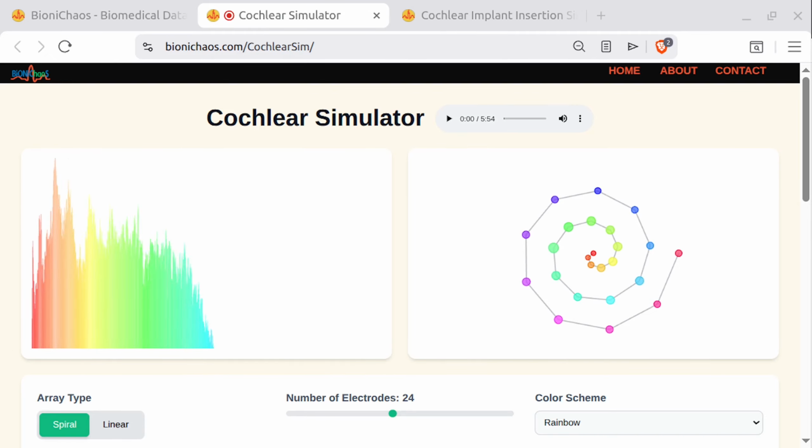Look, tinnitus, that constant maddening ringing or buzzing in the ears, is already present in about 80% of patients with profound hearing loss before they ever sit in my surgical chair. Right, the brain is starved for sound. Exactly. Their brain is starved for sound, so it creates phantom noise. And the implant actually serves as a powerful therapeutic tool here. The clinical data shows that 60% of these patients experience a significant drop in their tinnitus functional index scores after getting the implant. 60%. Because we are feeding the auditory nerve real signals again, the brain actually stops screaming.